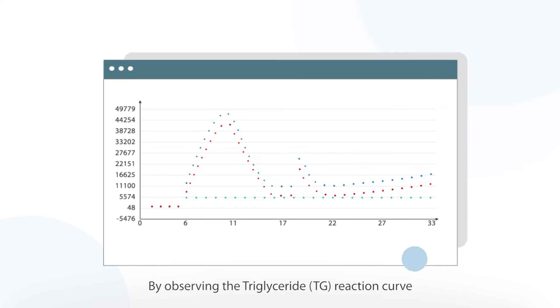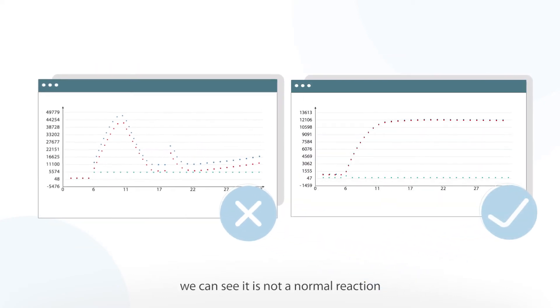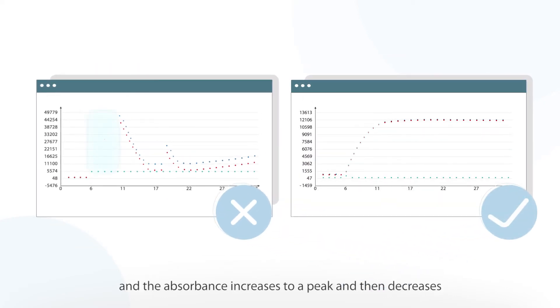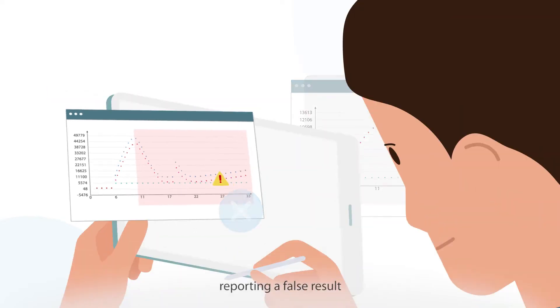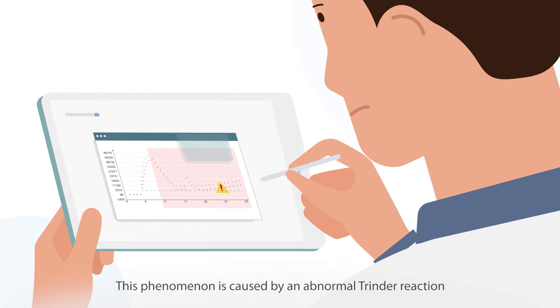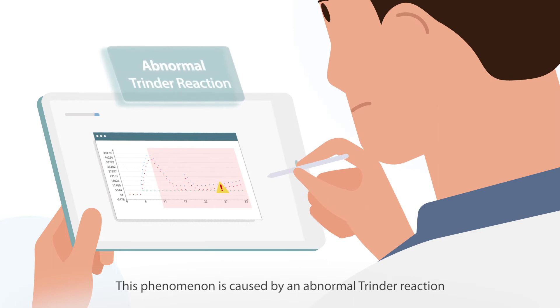By observing the triglyceride reaction curve, we can see it is not a normal reaction and the absorbance increases to a peak and then decreases, reporting a false result. This phenomenon is caused by an abnormal Trinder reaction.